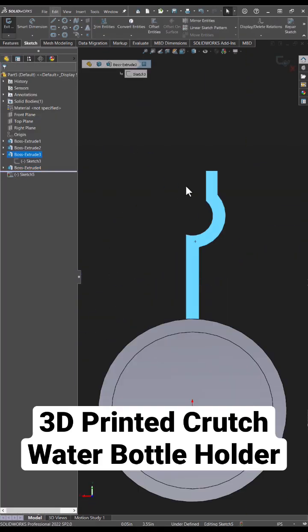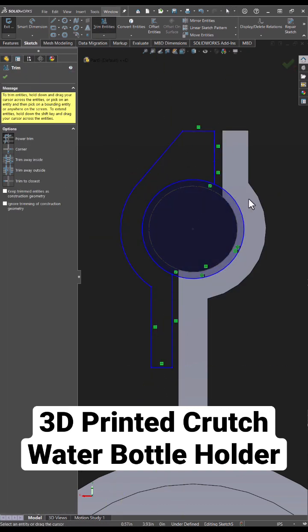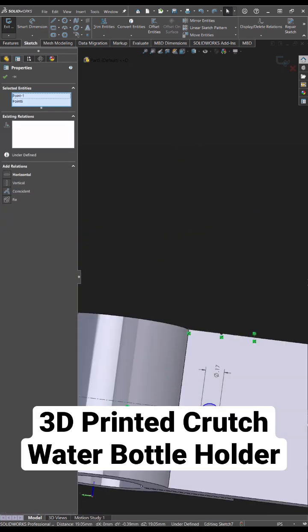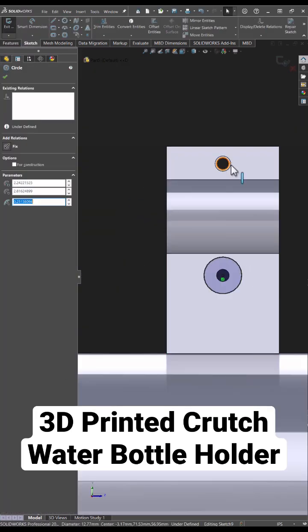I used a split clamp design to mount it onto the crutch and I have a three and a half inch hole for the bottle. The entire piece is about a quarter inch thick. I think this will be adequate for the loads expected.